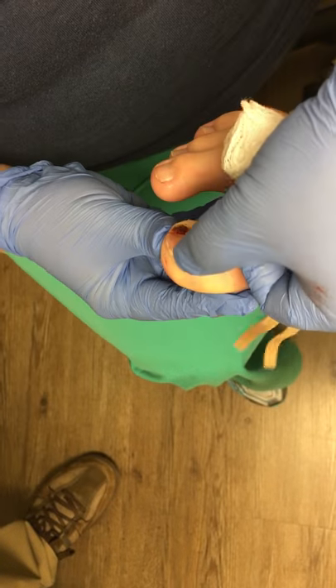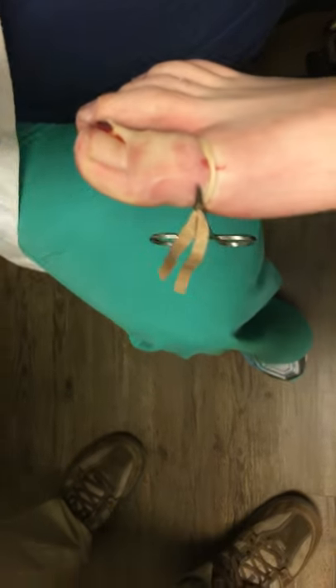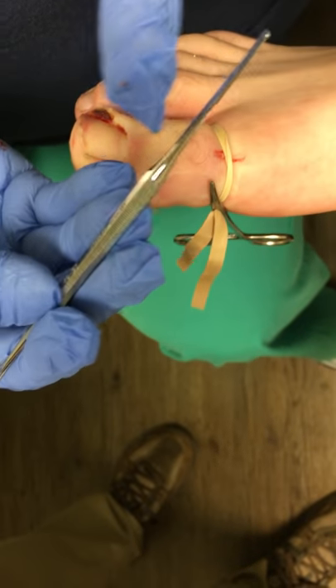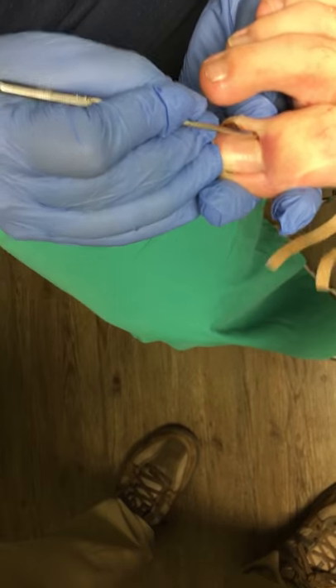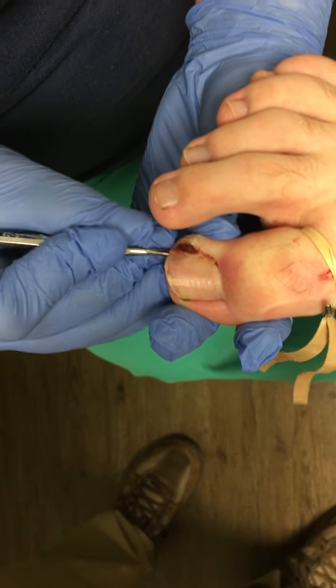You can tell the way he's been cutting his toenail is not necessarily at the best angle, which is straight. So the first thing we're going to use is a spatula — a two-ended spatula. Some people can use a freer elevator, anything that's an elevator. What you want to do is free the nail folds from around the nail border.